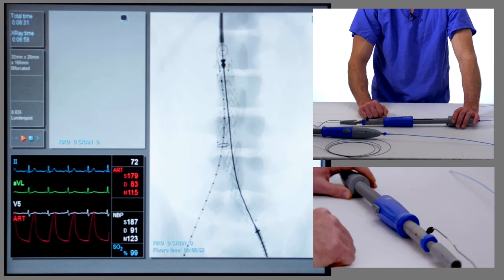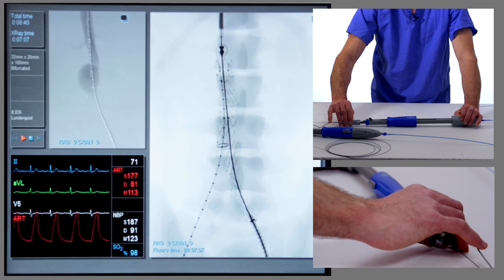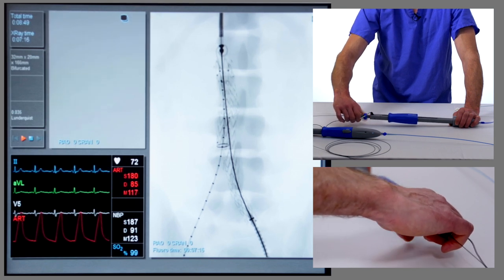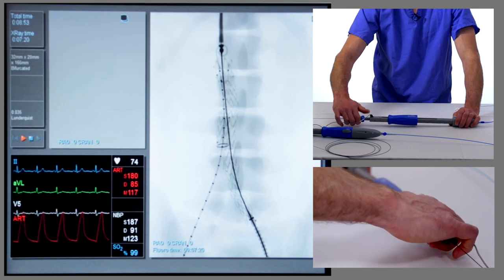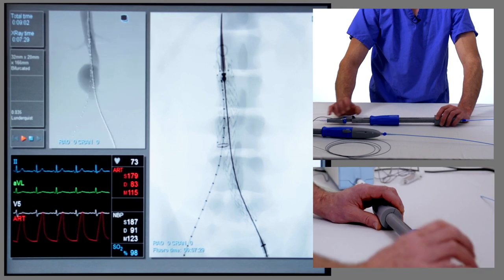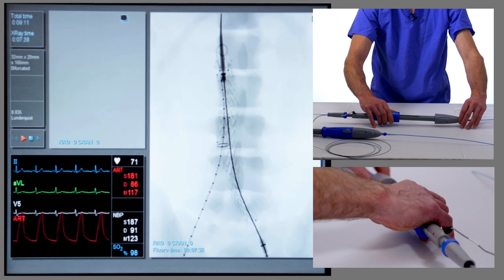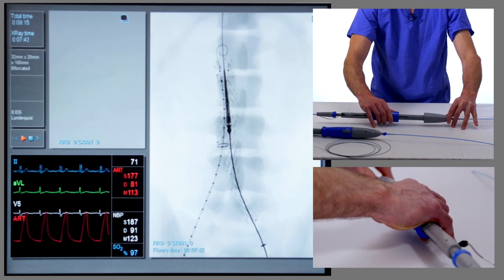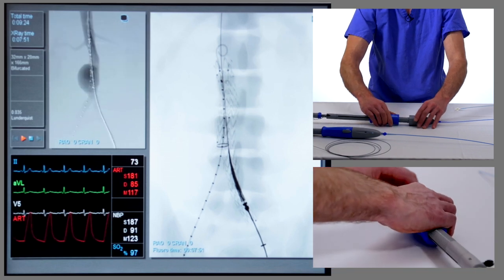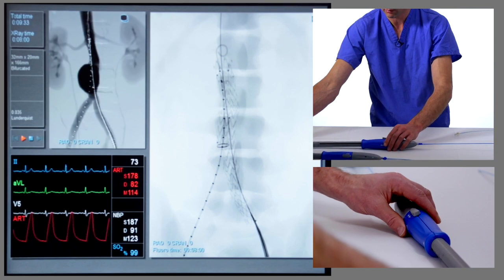We now need to remove the delivery system, so we need to recapture the proximal nose cone. We advance the system a little to take it above the bare metal stent of the main graft, then reverse the direction of the little blue handle at the back — you can see the nose cone is being brought back down, captured, and locked into place. We withdraw the whole delivery system a little below the proximal uncovered stent and recapture the nose cone by pulling back on the grey trigger, keeping the right hand on the blue handle, and with the left hand pulling the main delivery system backwards. If you have an assistant at this stage, it's useful to get them to advance or at least maintain the position of the guide wire. Pull back until the two dots come together, then remove the delivery system out of view.